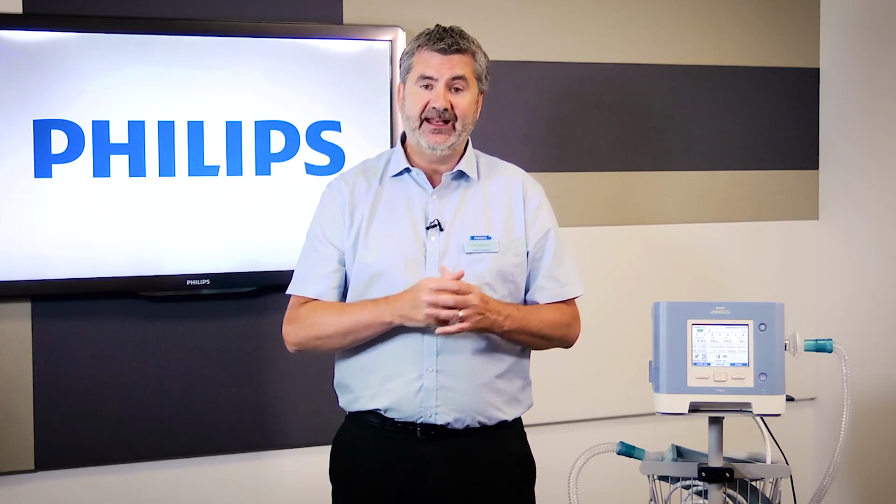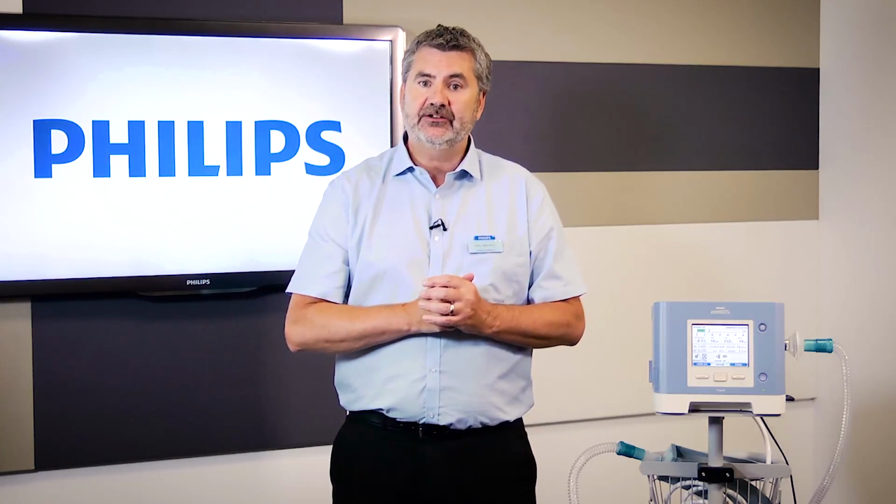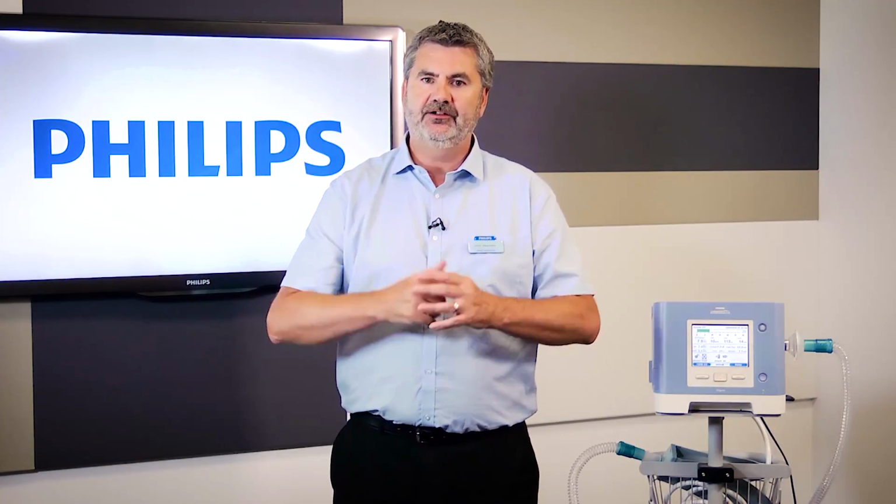Of course, its other intended uses are for BiPAP, and this is equally licensed for invasive use as well, and it has familiar invasive modes, which will be touched upon in another module. So it is a CPAP, BiPAP and non-invasive ventilator. It's actually licensed equally to be used on paediatric patients as well as adults, and you can use it from 5 kilograms, so pretty much a baby, up to an adult.